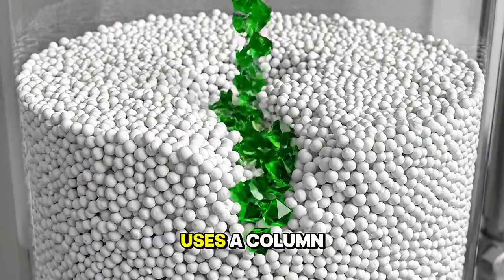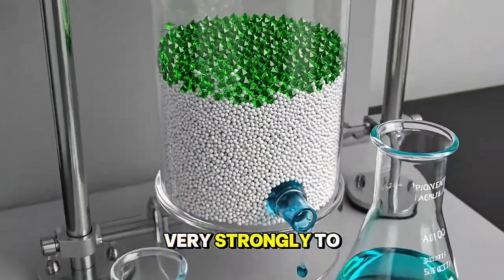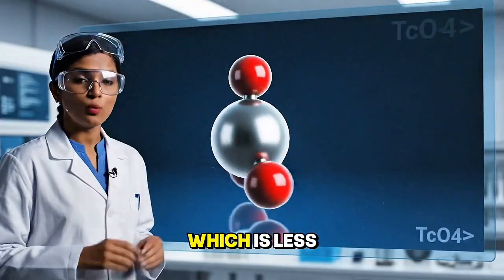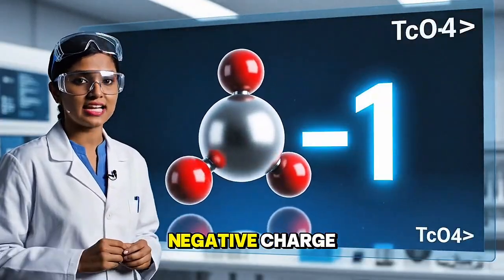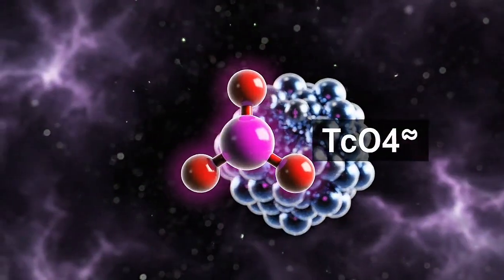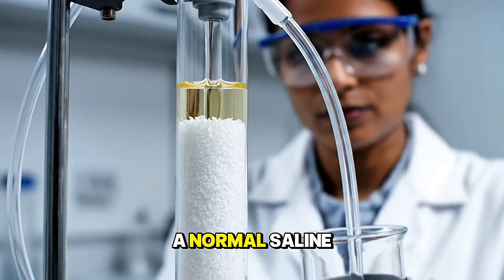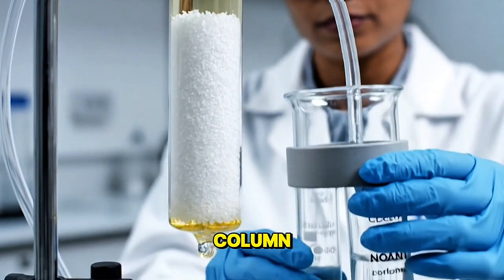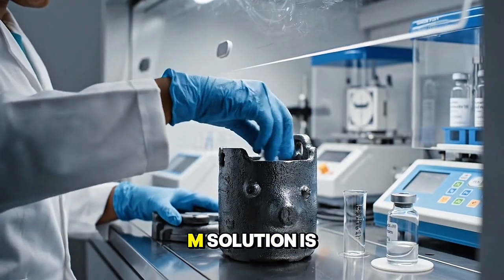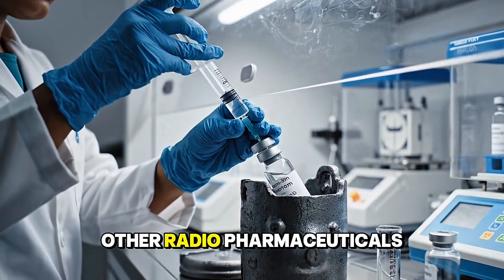The generator system uses a column filled with alumina. Molybdate ions bind very strongly to alumina. When Mo-99 decays, it forms Technetium, which is less tightly bound due to its single negative charge. A normal saline solution is then passed through the column, washing off the pertechnetate. This Tc-99m solution is now ready, either for direct injection or for preparing other radiopharmaceuticals.